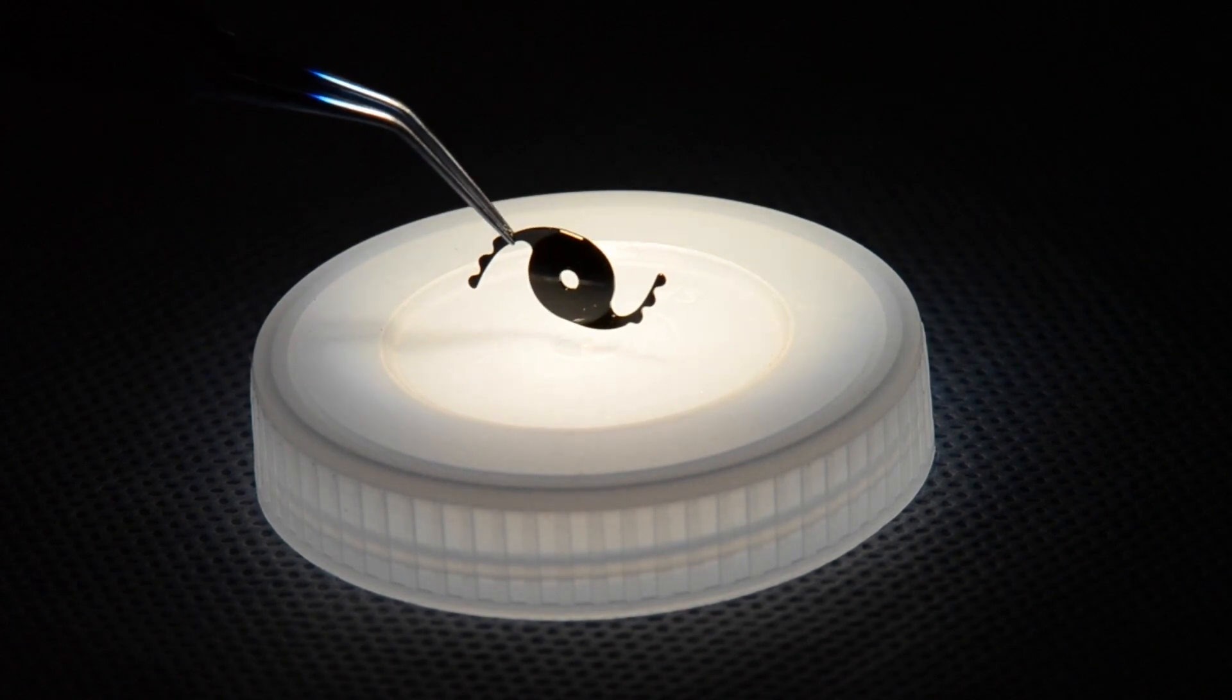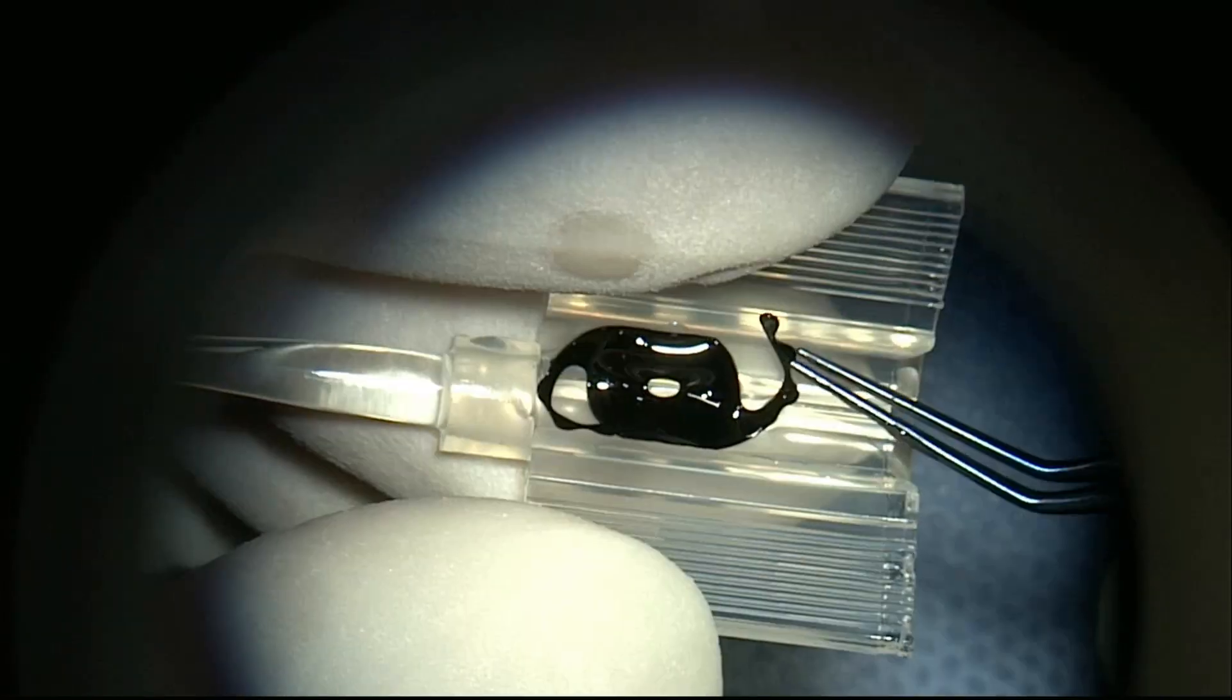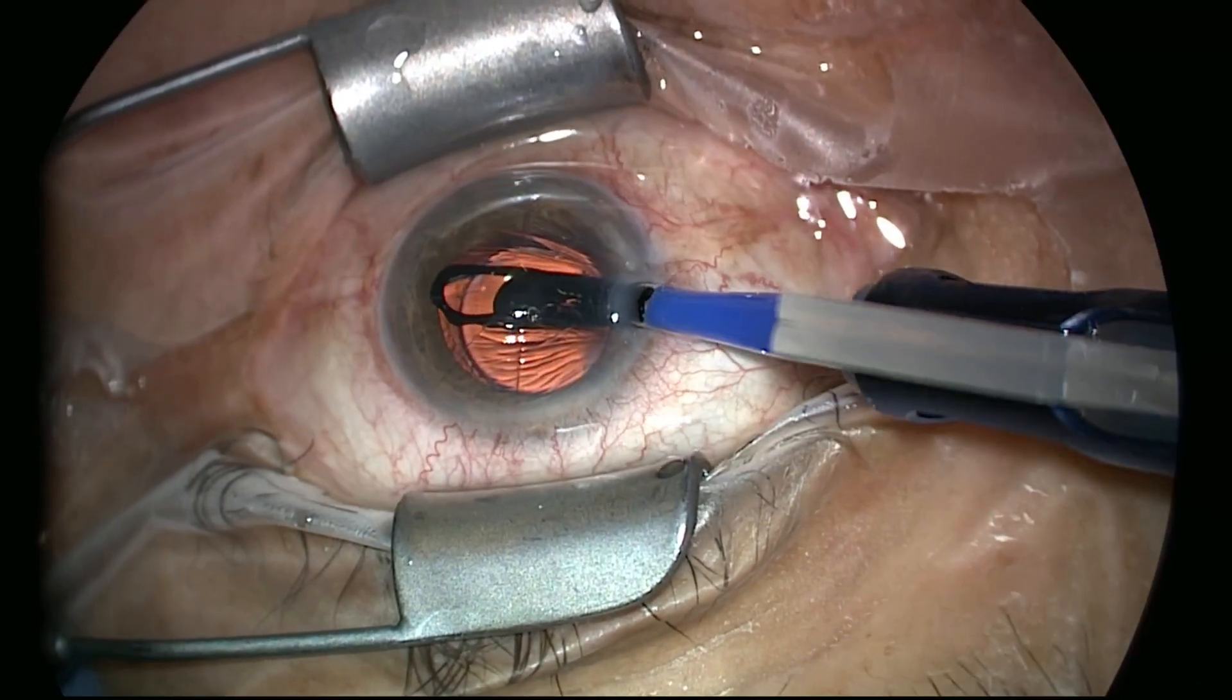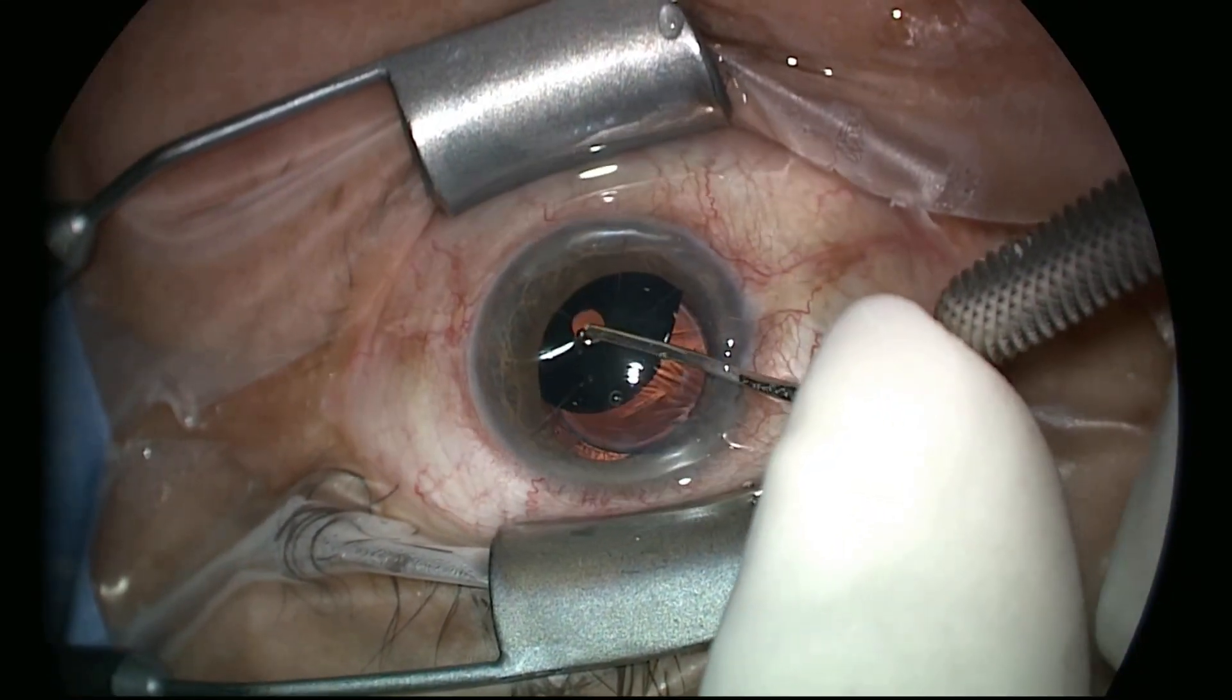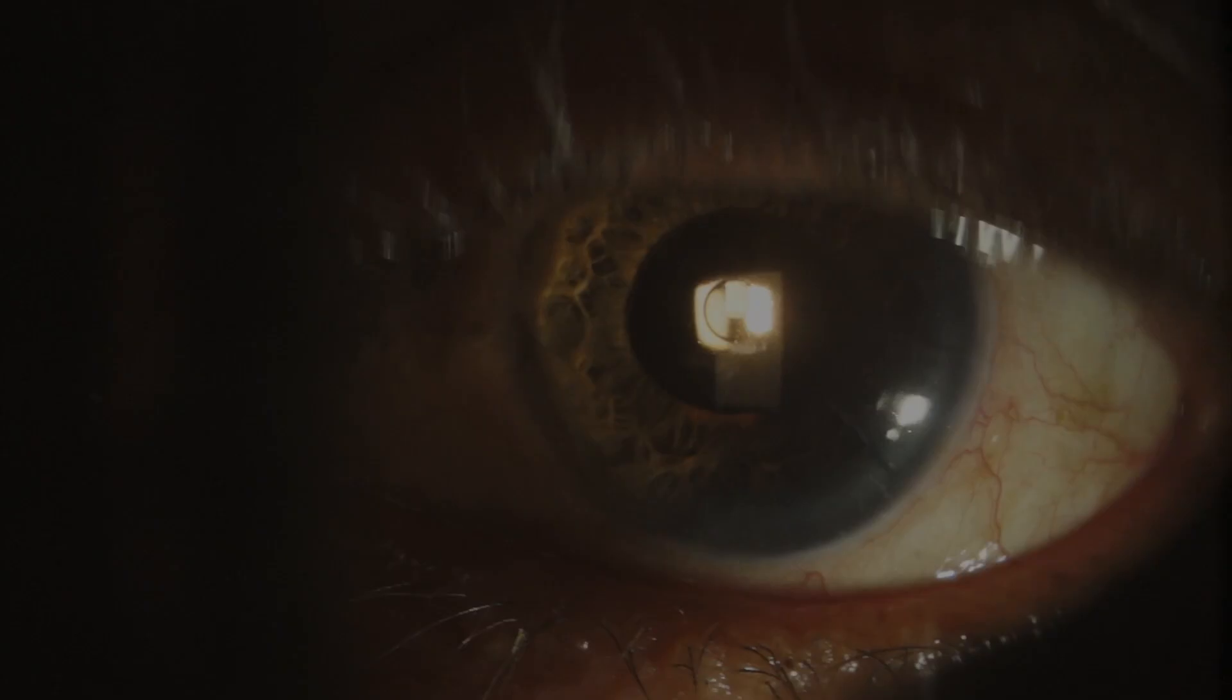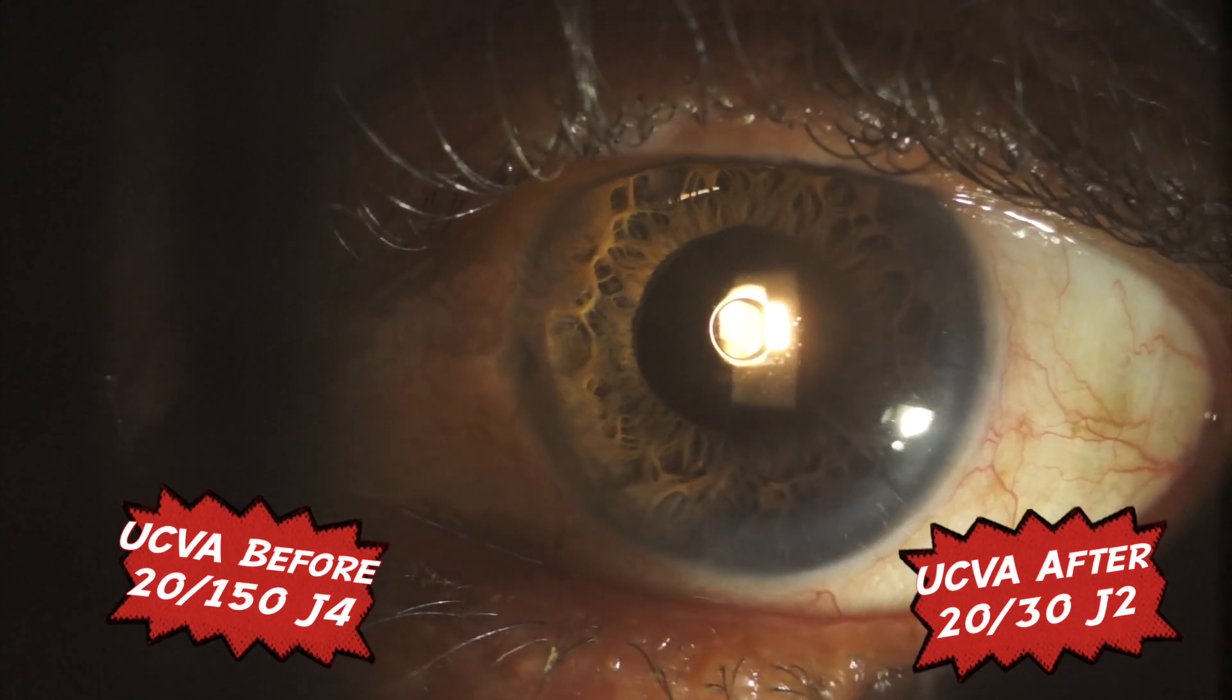We decided to address this problem with this simple, yet elegant solution. The device is implanted through a single 2.2 mm corneal incision and is directed to the ciliary sulcus. This is the eye the day after, with excellent centration and great improvement in visual acuity.